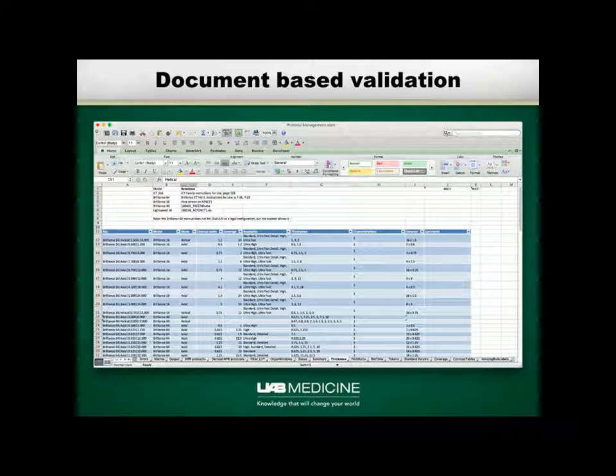In addition, before I take this to technologists and radiologists to review, I do a pre-validation on it. What that means is I've got another workbook that contains a lot of information in it, such as what image thicknesses are available for which settings on which scanners. For example, we do most of our body protocols using 2.5 millimeter thick axial series. We just got that new Siemens Force.